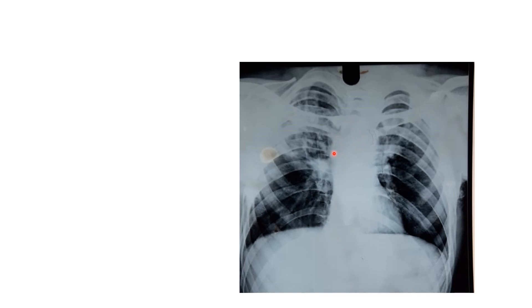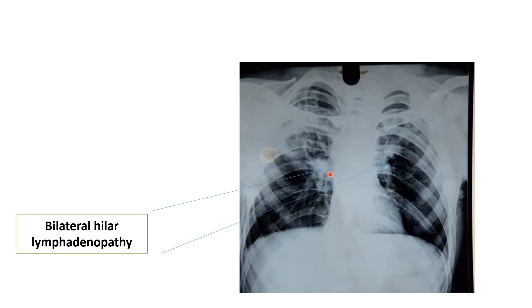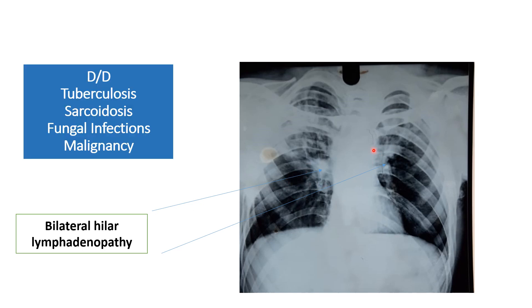In this x-ray, opacity is present in the hilar area in both lung fields — in the left hilar region and the right hilar region — because of bilateral hilar lymphadenopathy. Whenever a patient has hilar lymphadenopathy, you have to differentiate whether it may be due to tuberculosis, sarcoidosis, fungal infection, or malignancy. Hilar lymphadenopathy is characteristically seen in all these types of infections and malignancy.